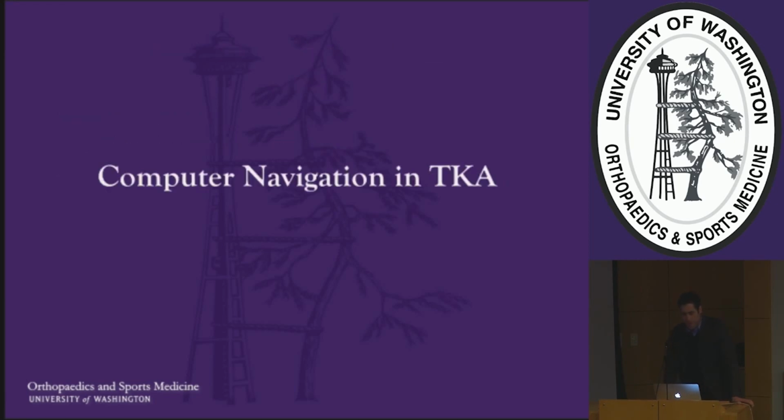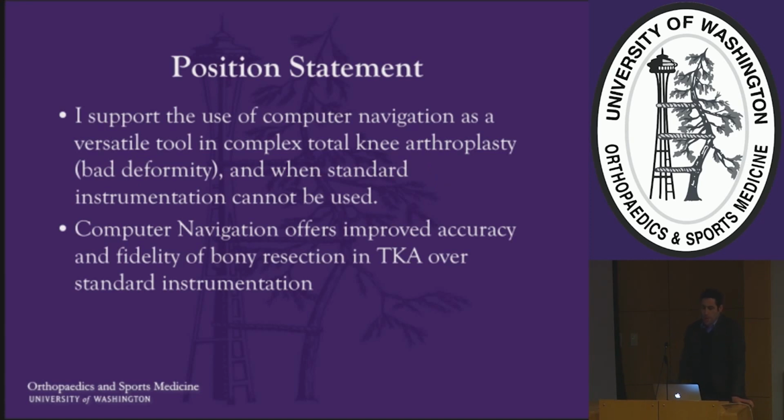So computer navigation in total knee arthroplasty is something that I support. I support the use of computer nav as a versatile tool in complex total knee arthroplasty, so in the setting of very large deformities that need to be corrected, or when standard instrumentation can't be used. I don't think it's a magic bullet that we need to use every time. If you're a well-trained arthroplasty surgeon, you should be able to put components where they need to be, but I think it does offer a way to improve accuracy and fidelity in bony resection.